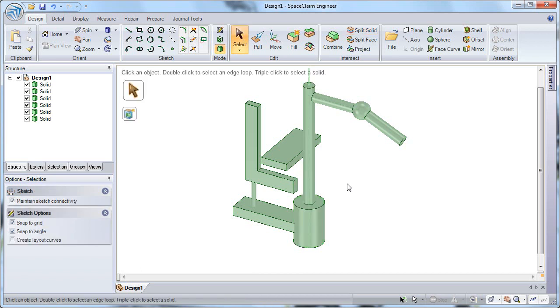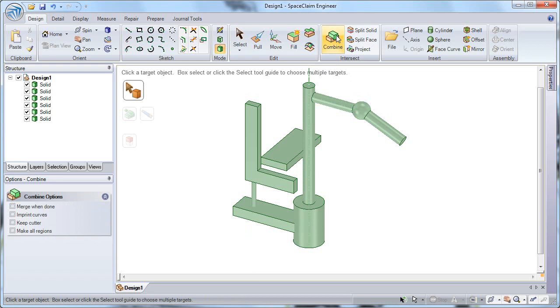I can also use the Combine tool from the Intersect group to combine two solids together, and you can read that status message that shows up in the top left. So I'm going to select my base. Now notice that it's asking me to select a cutter object to cut into that base, but I can also toggle between the merge feature by holding down Control or selecting it in the tool guide. So as I hold down Control, I can now select another body, and it will merge those two together instead of cutting.